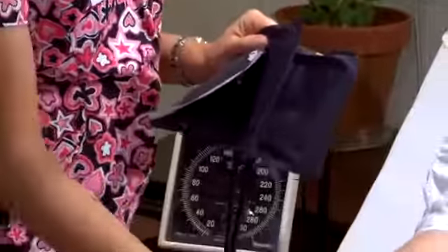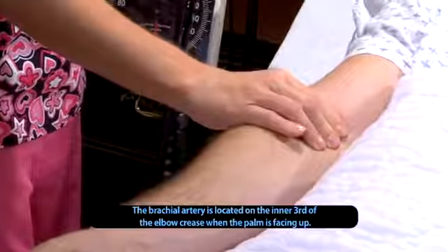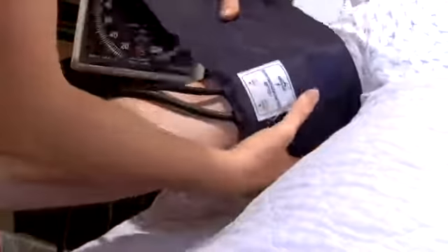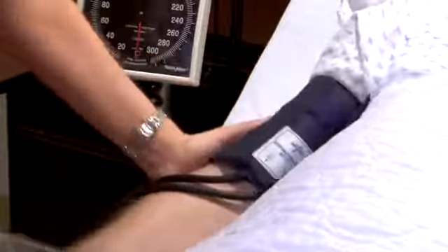Now we're going to put on the blood pressure cuff and I'm going to check for your brachial artery. Line this up. You can go ahead and set your arm down.